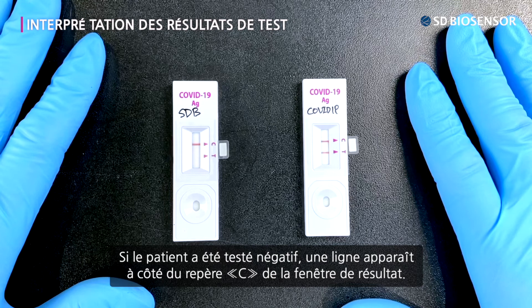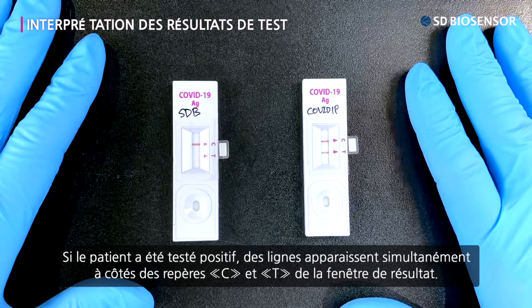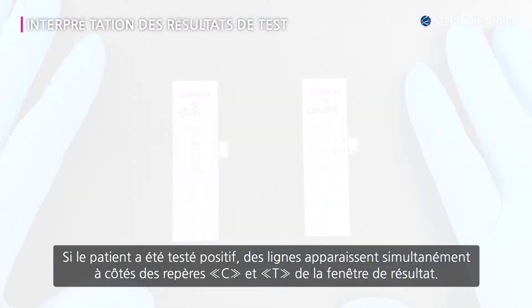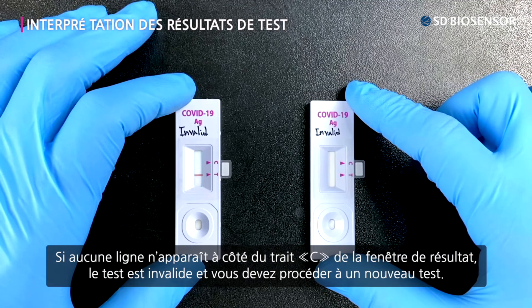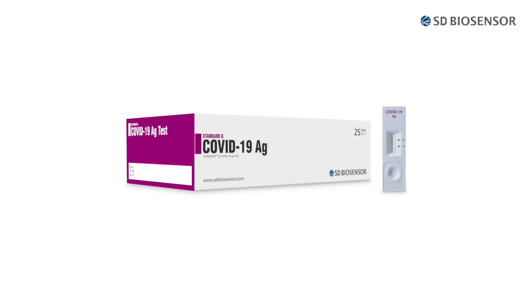If the patient tested negative, one line appears in the C-line part of the result window. If the patient tested positive, lines appear in both the C-line and T-line part of the result window. If no lines appear in the C-line part of the result window, the test is proved to be invalid and you need to proceed with a retest.